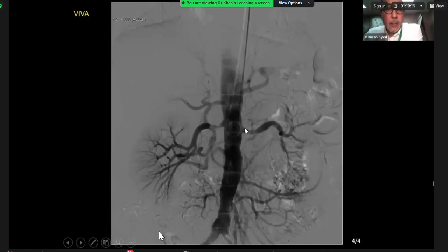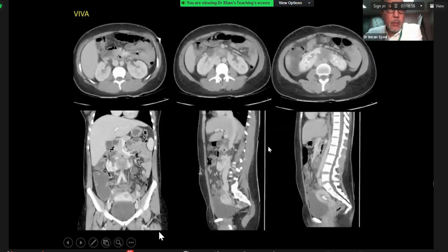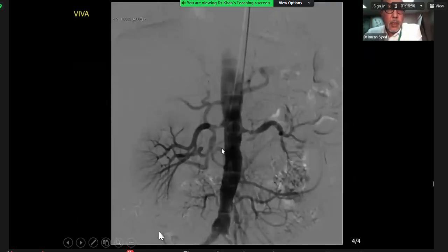And here indeed you've got bilateral changes within an aorta. The aorta as a whole, on a background, so this is important, you say bilateral renal artery stenosis on a background of an ectatic aorta. Okay, so this could be FMD or this could be renal artery stenosis, but in this case, this was bilateral renal artery stenosis in an older patient.